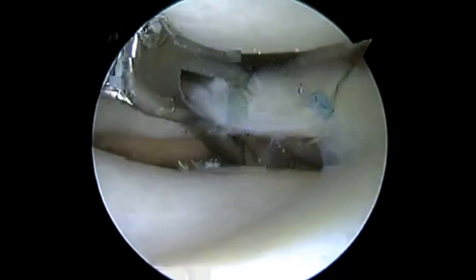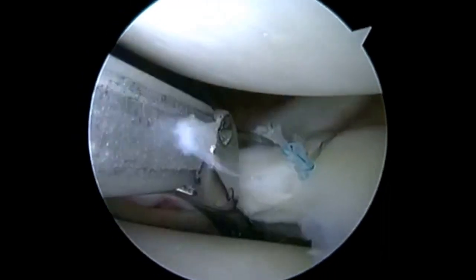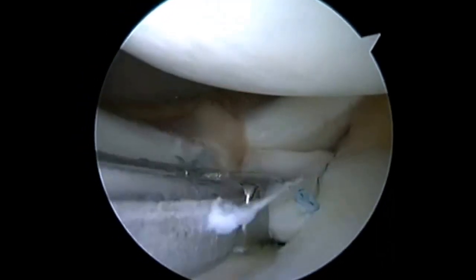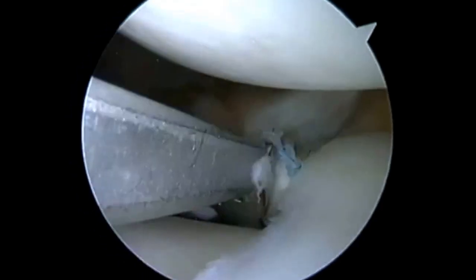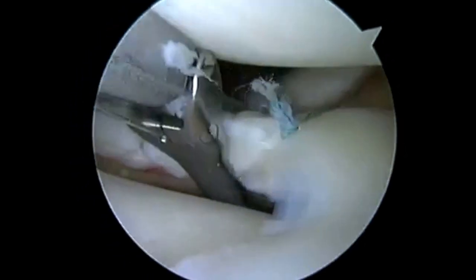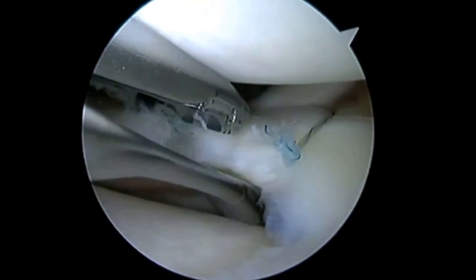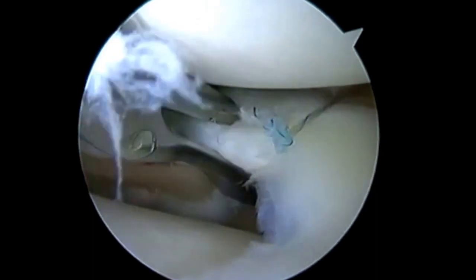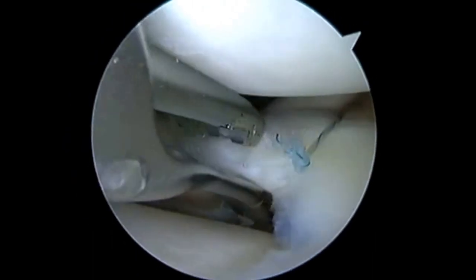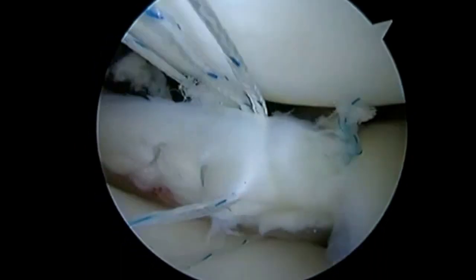I've got an additional anterior stitch already placed, and here's a problem site because I can't get the upper jaw into position. So what I do here is I invert the device. I've got my lower jaw going over the top of the meniscus, my upper jaw going down over the slope of the tibia. This allows me to pass over the meniscus posteriorly down into that jaw, especially in tight areas. This can be advantageous because you're able to take advantage of the slope of the proximal tibia to get your upper jaw lower and more deep over the meniscus.